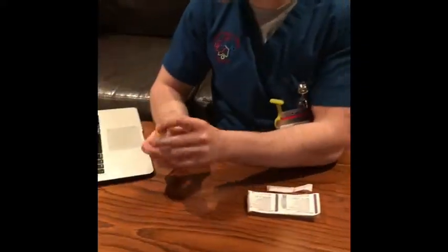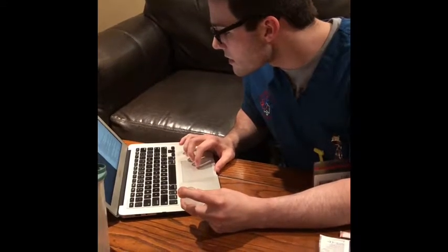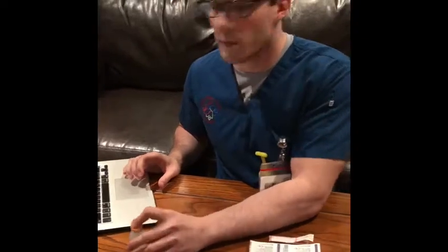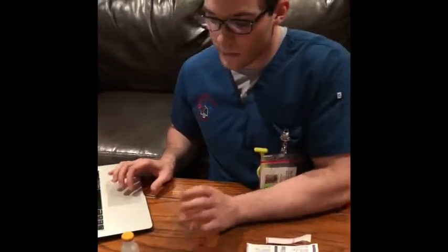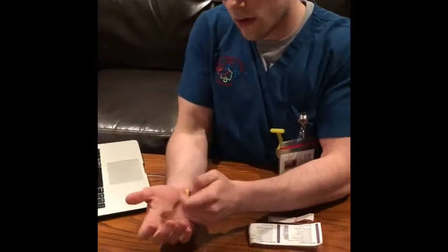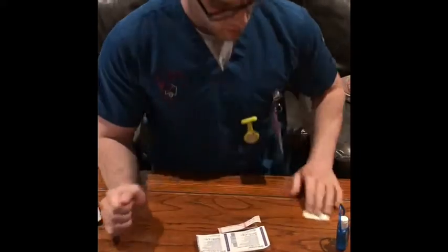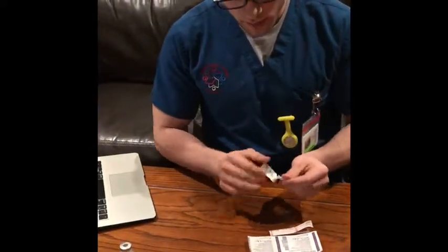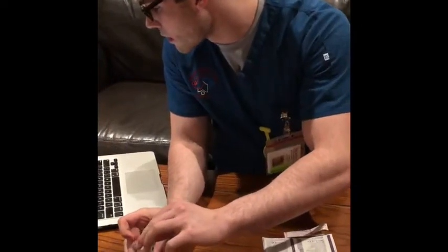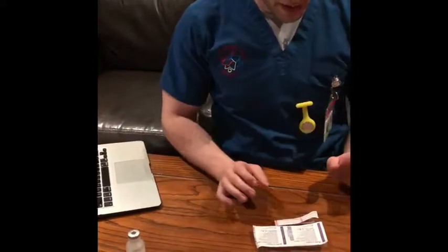So we have the medication here, and this was the 5,000 units of heparin, and the concentration is 5,000 units per 1 milliliter, so we'll be administering 1 milliliter of heparin. We can begin by popping off the cap here, and then we can clean that with an alcohol swab, going from in to out. And now while that dries, we can prepare the needle itself.